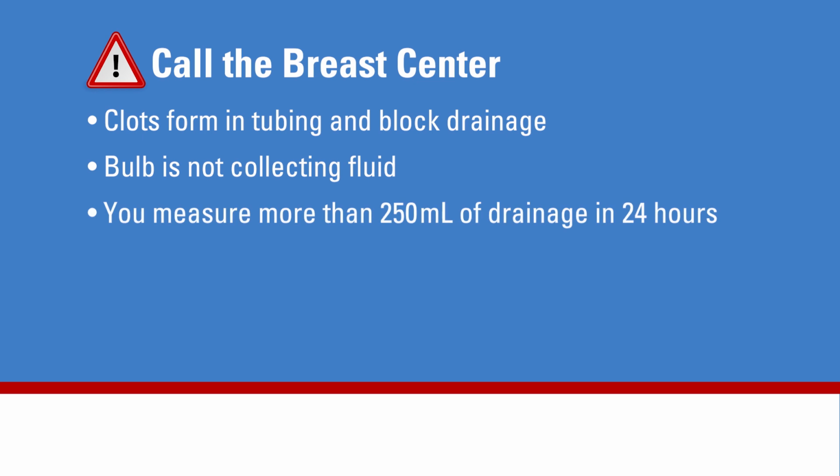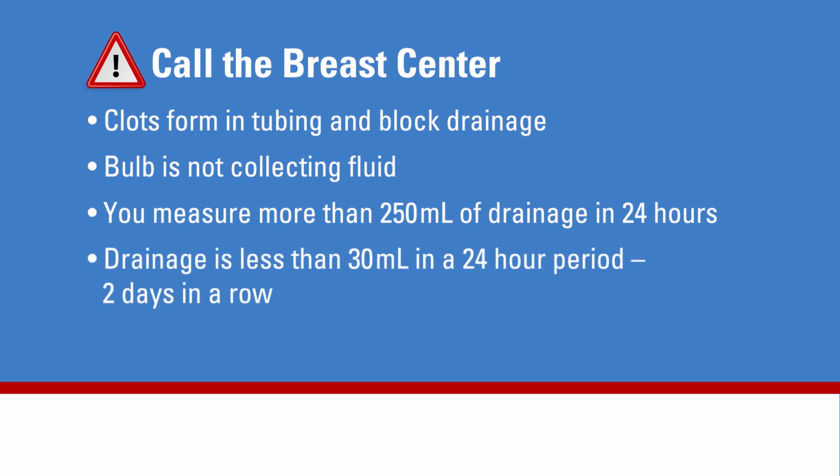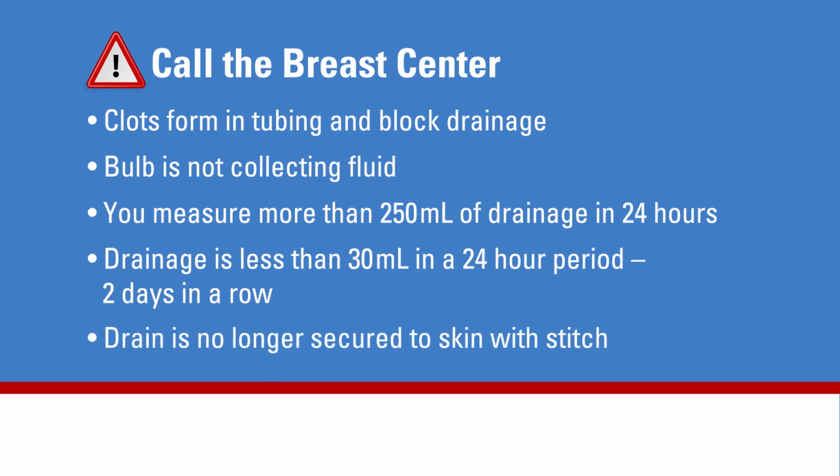If you measure more than 250 milliliters of drainage from one bulb in 24 hours. If the amount of drainage is less than 30 milliliters in a 24-hour period for 2 days in a row. If the drain is no longer secured to your skin with a stitch.